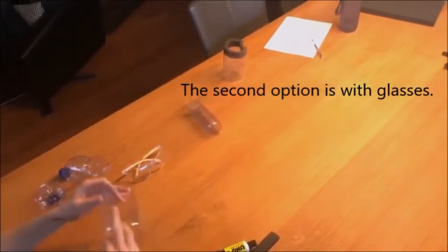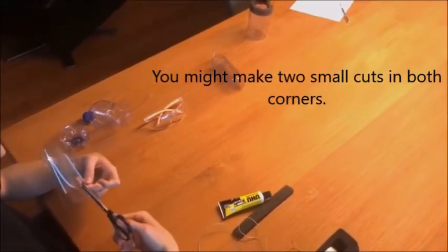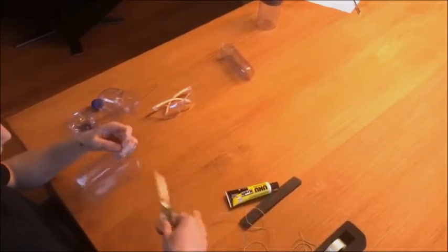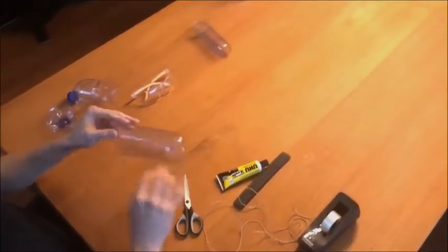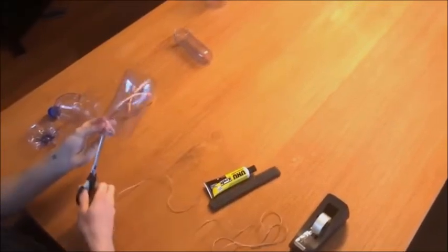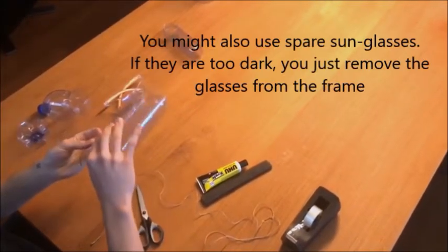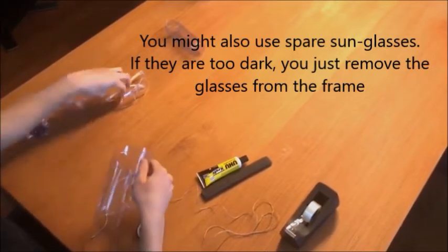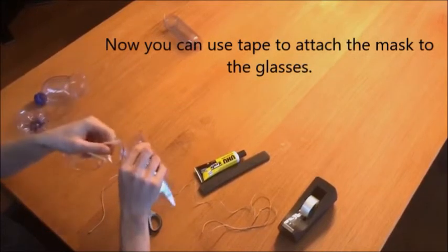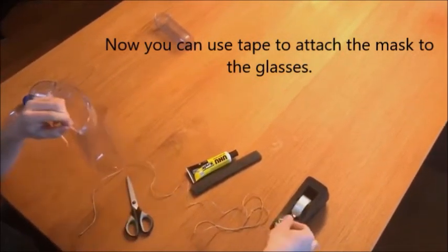The second option, which I'll show you now, is with glasses. You have to make two small cuts in both corners and fold it over — second side as well. Now you can use it on the glasses with some tape to help secure it.